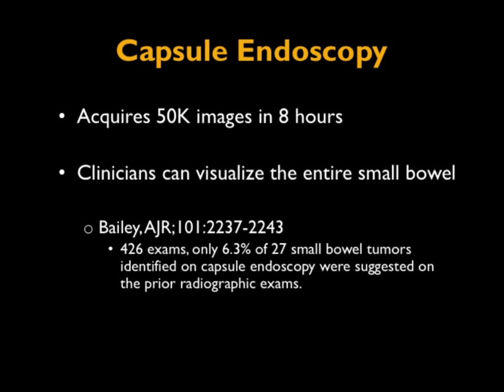One article going back when talked about how the majority of lesions picked up on capsule endoscopy were missed by conventional imaging, and that has not held up over time. I've been on panels with some of the leading endoscopic people doing this capsule, and they'll say CT is a study of choice. If CT is negative, then go on to capsule endoscopy.